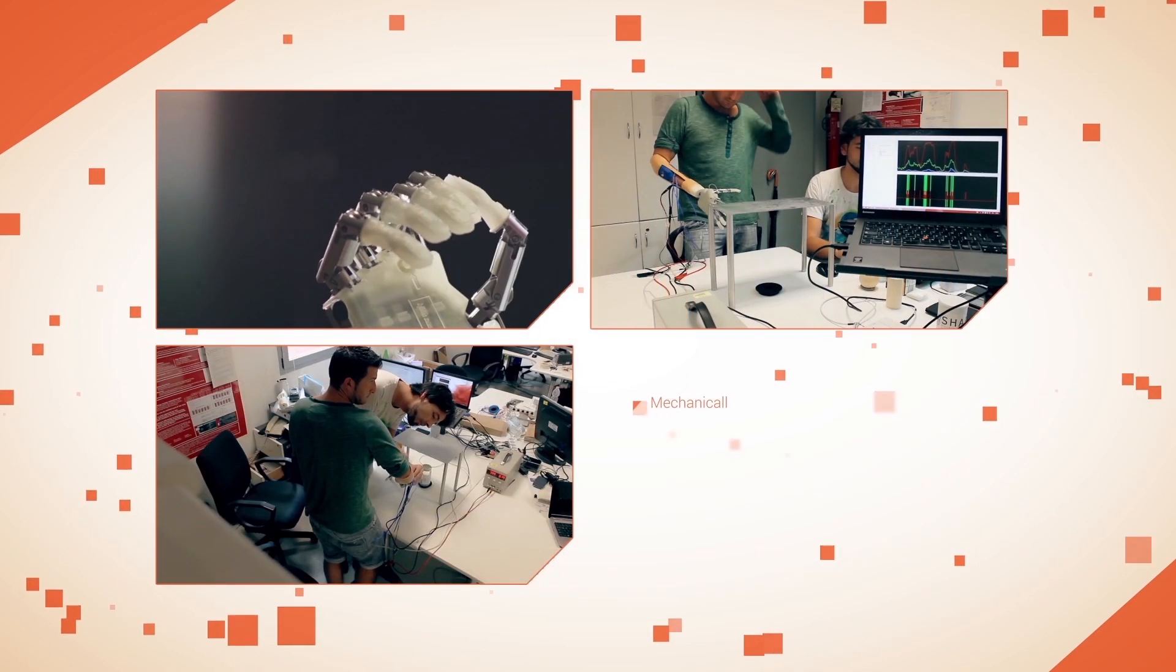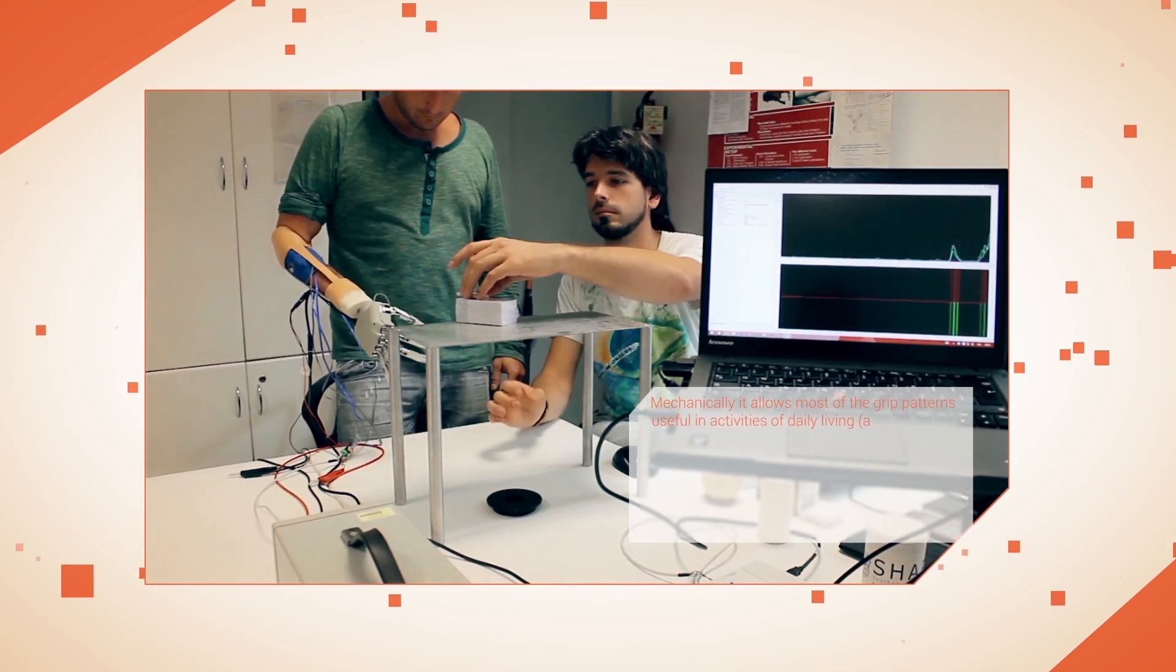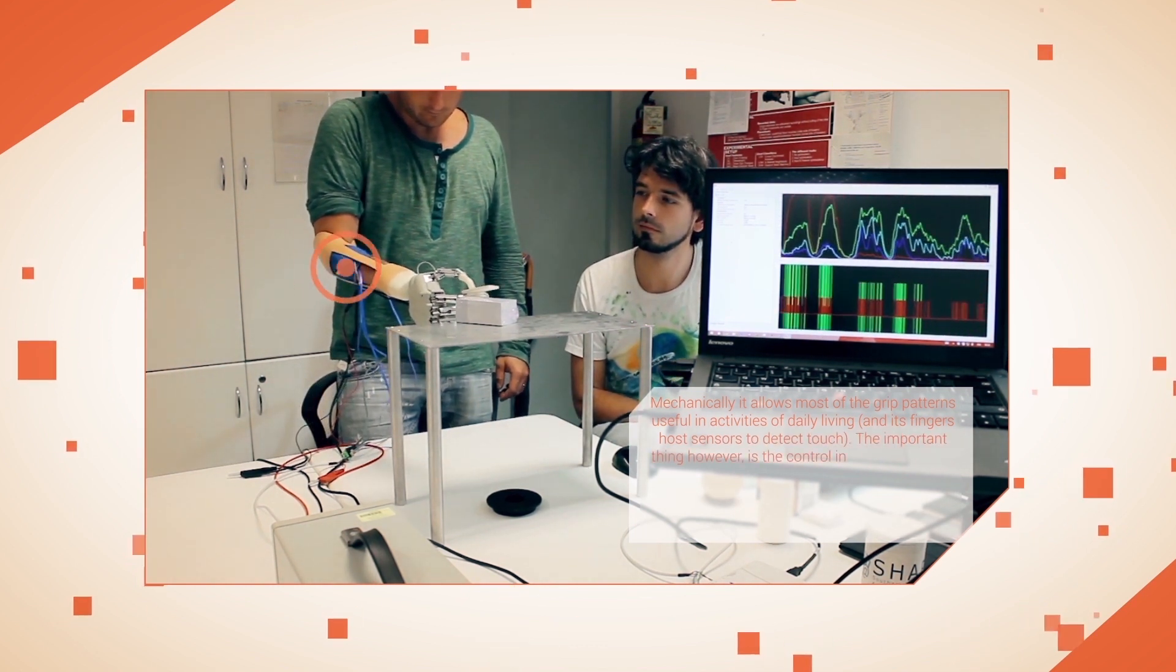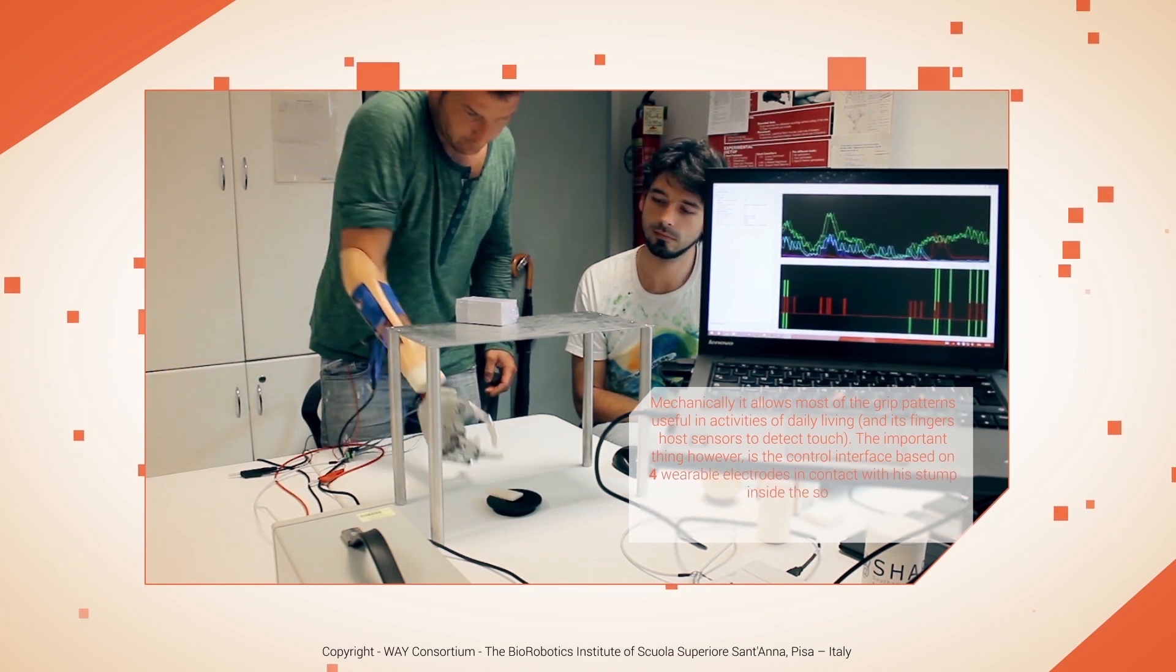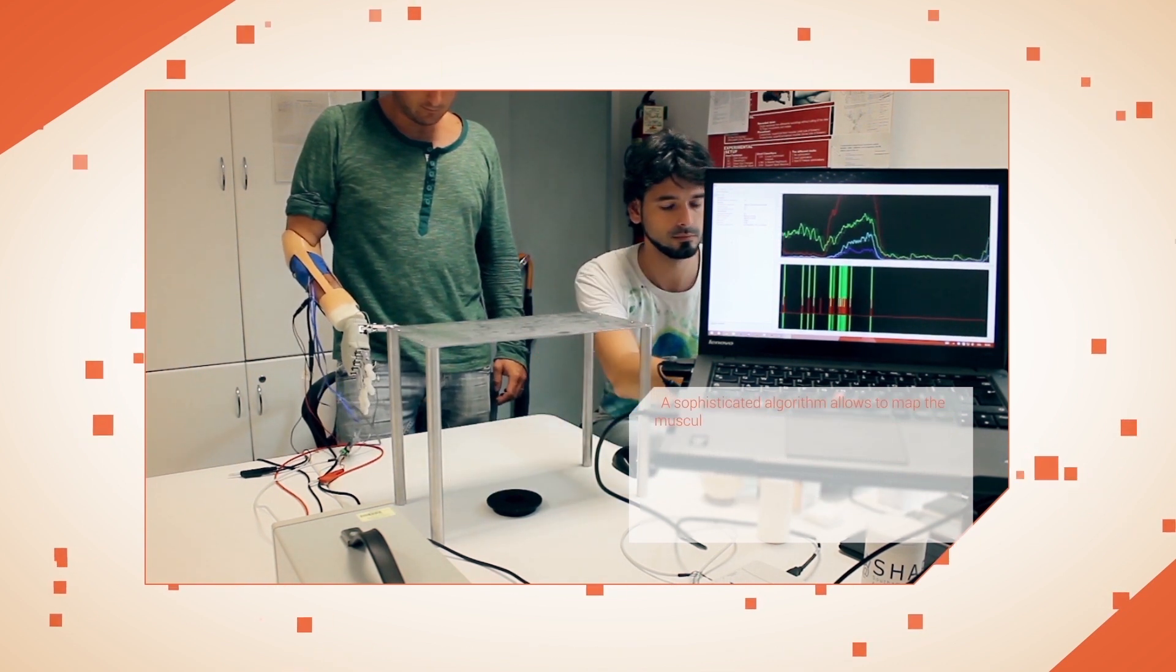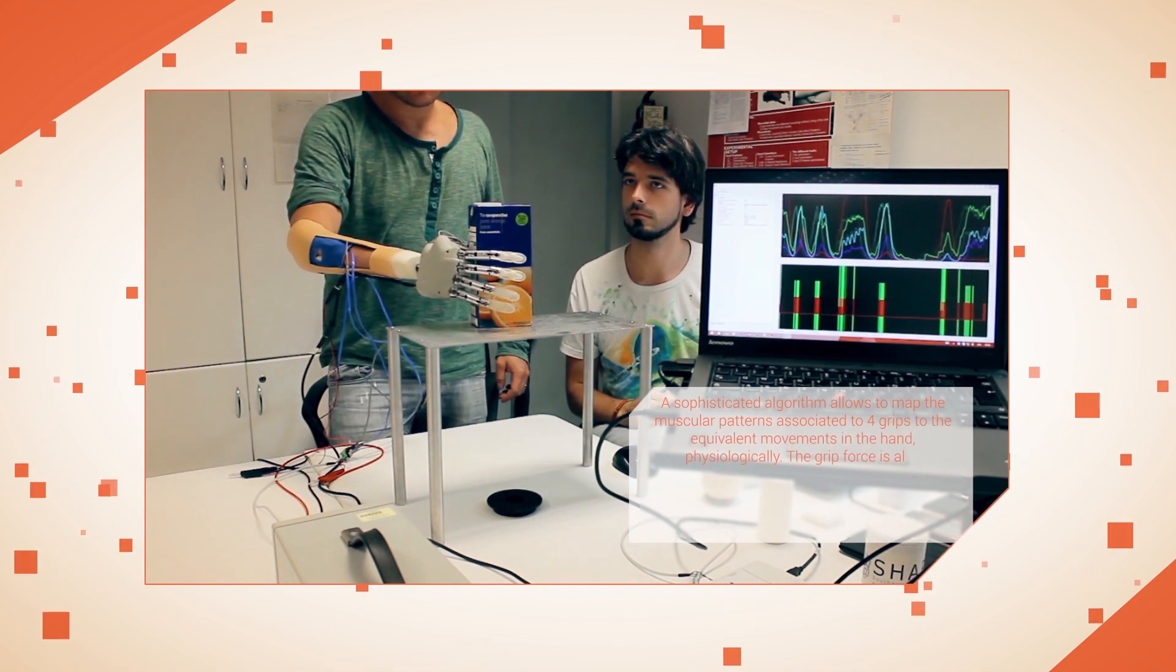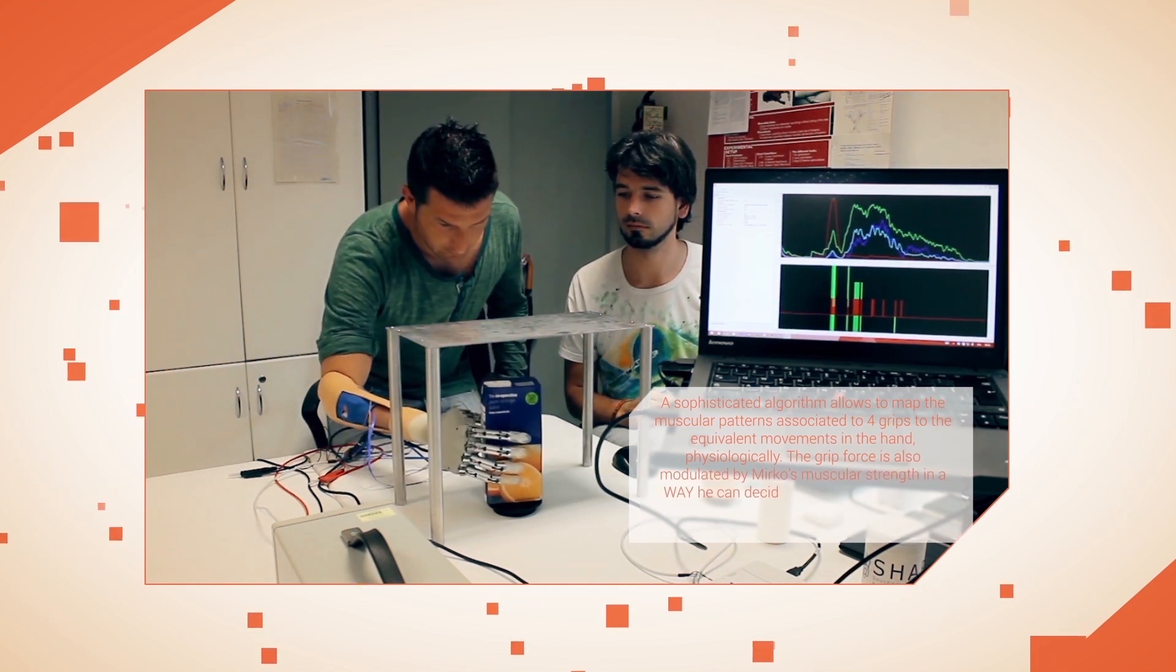The hand he is controlling is one of the most advanced multifunction hands developed at this institute. Mechanically, it allows most of the grip patterns useful in activities of daily living, and its fingers host sensors to detect touch. The important thing, however, is the control interface based on four wearable electrodes in contact with the stump inside the socket. A sophisticated algorithm allows mapping the muscular patterns associated to four grips to the equivalent movements in the hand.